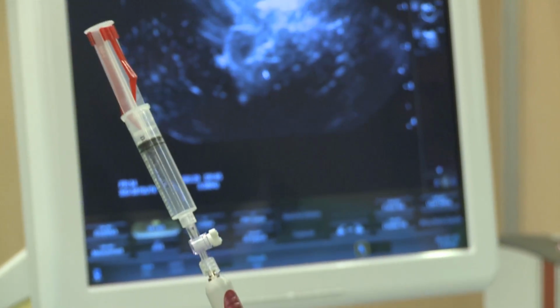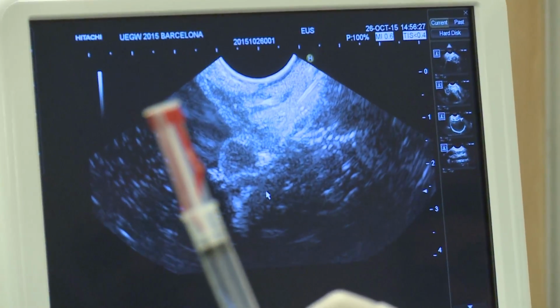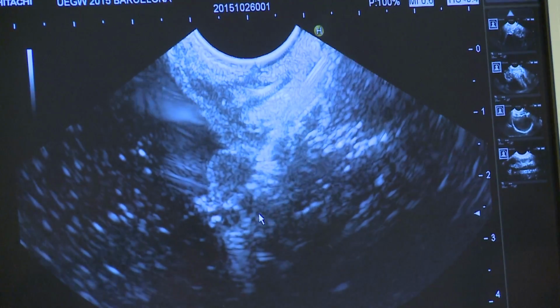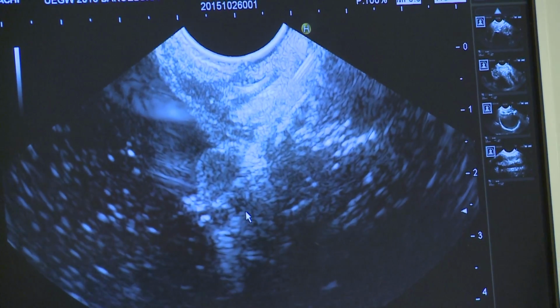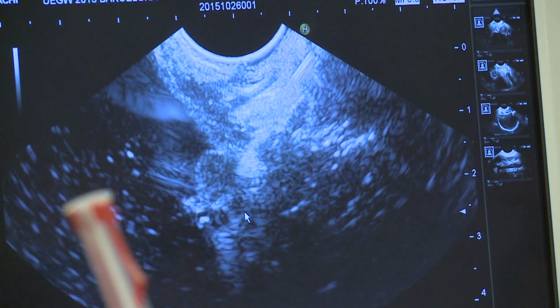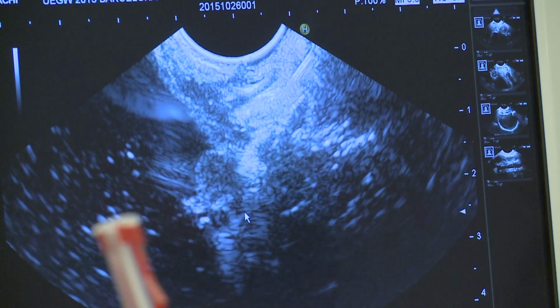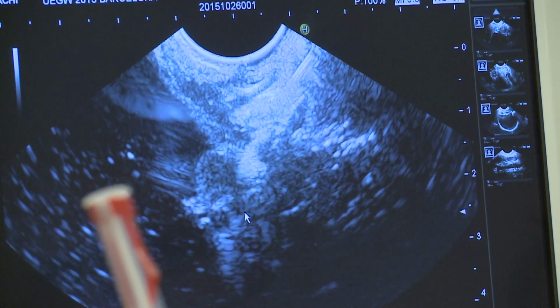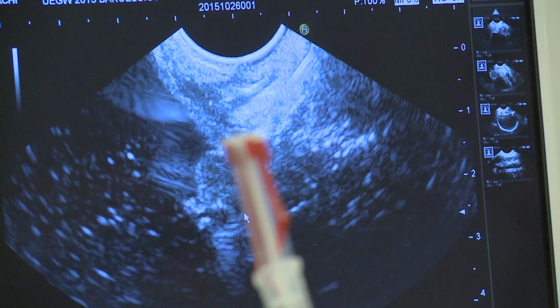Go in and in, I get into the lesion, and for him, this is an additional pass. So he will just open and do the punctures again. You see, we are inside of the lesion again. So this will be a second pass, okay? The advantage is that the study said that the use of the stylet doesn't matter. You are not going to increase your accuracy by using or not using the stylet, but you will reduce the time of the procedure by doing the passes without taking the needle out, okay? Well, we will just stop.